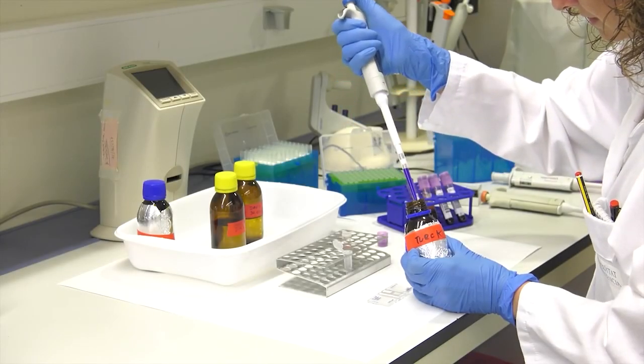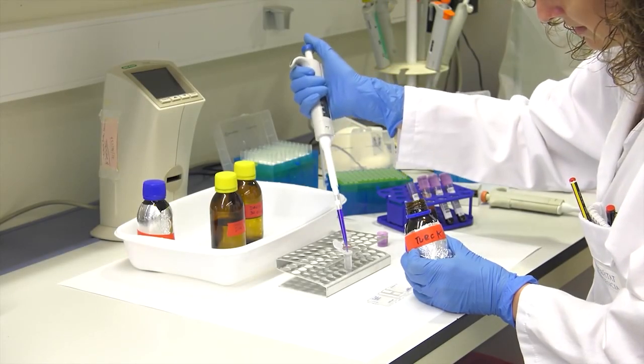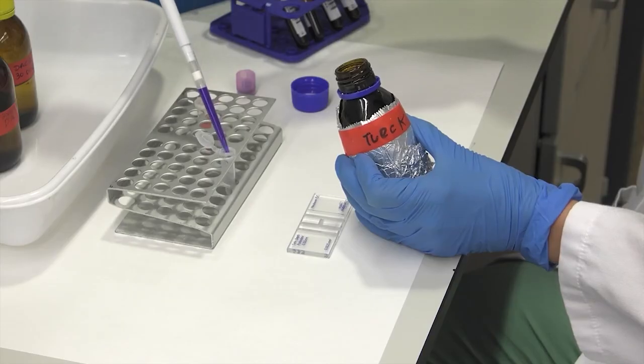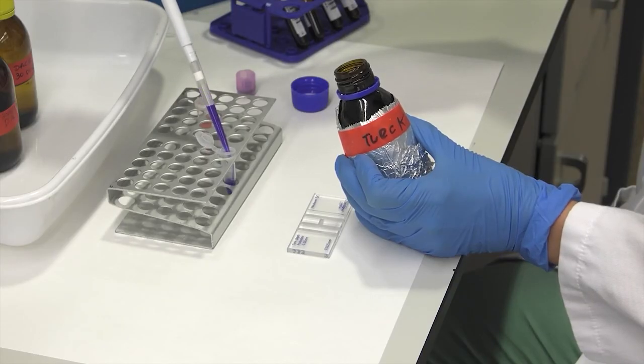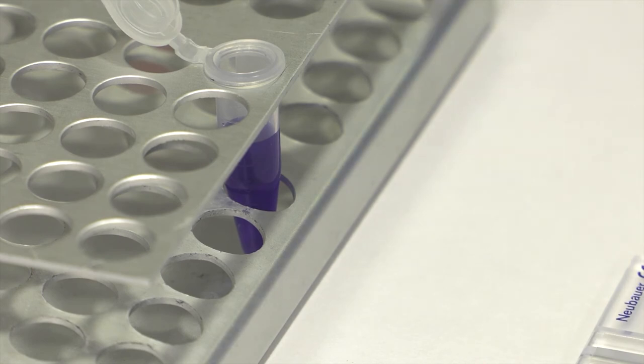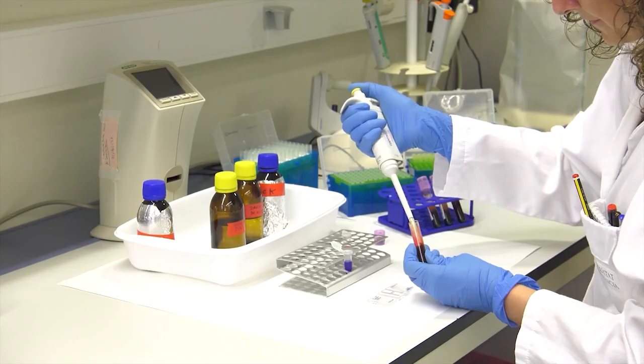The leukocyte count shall be performed in the same way as erythrocyte count. In this case, TURK's reagent is used to dilute the sample. This is a hypotonic liquid containing gentian violet to lightly stain the white blood cells and glacial acetic acid to lyse erythrocytes.